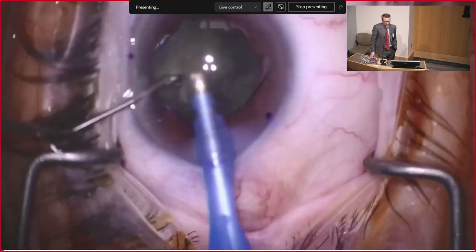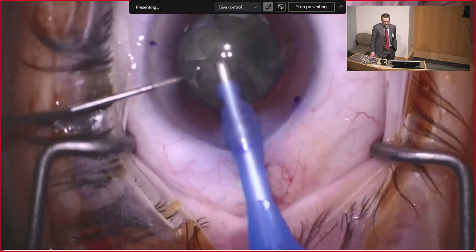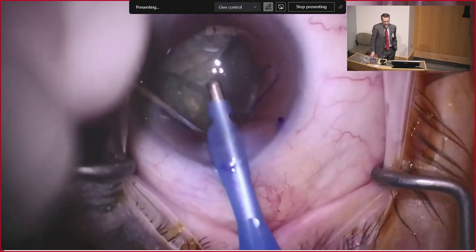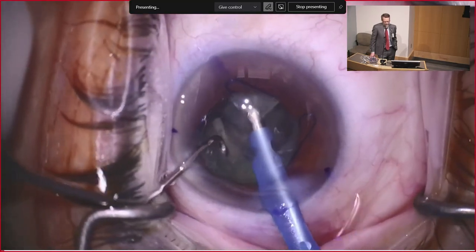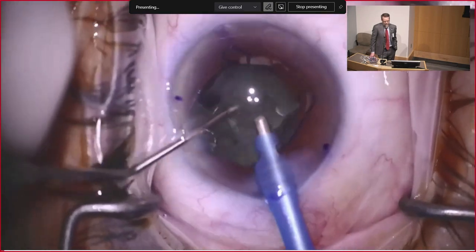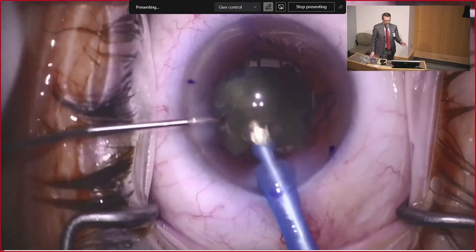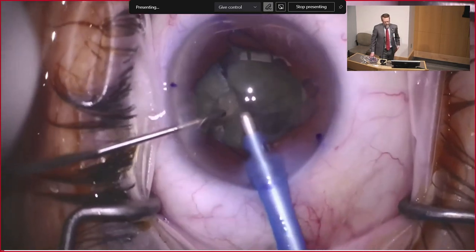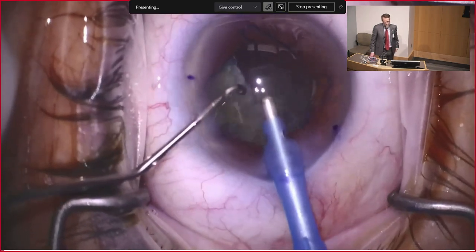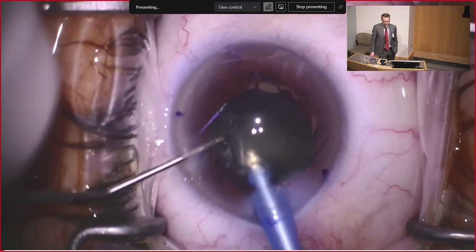This is kind of a 1.5 to 2 density lens, and you can see it pretty comfortably aspirates in. This is sped up 2x. I do operate more slowly with this, still within my first 50 cases. What I really try to do is put the fragments right at the end of the tip. Again, this really pulls things in directly in front, and I'm trying to limit the amount of energy I'm putting in the eye, the amount of that clicking that you're hearing. And again, it's not going to look a whole lot different from a typical phaco case.